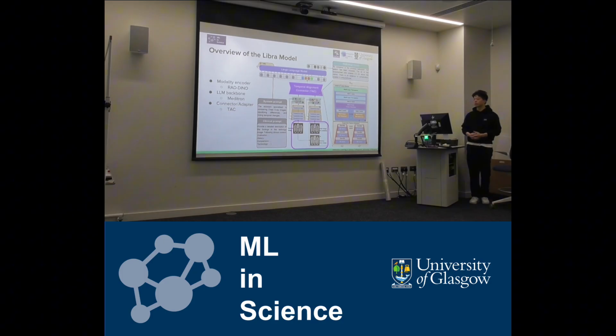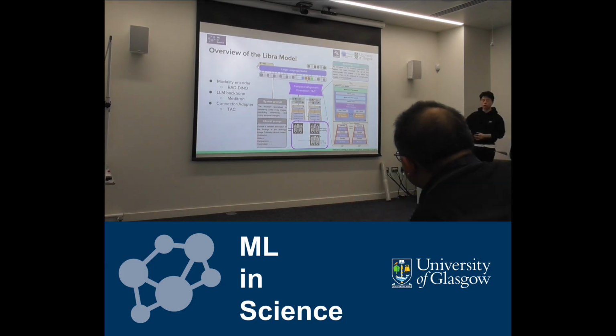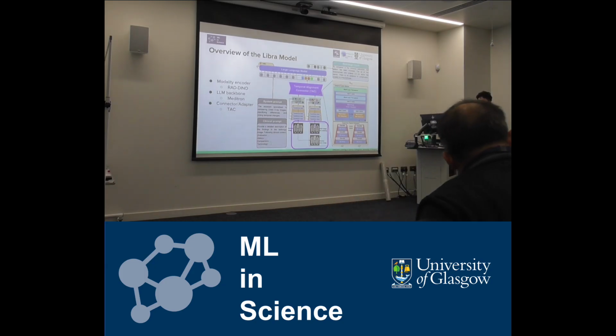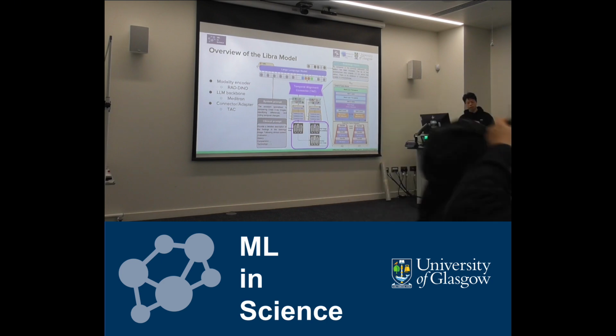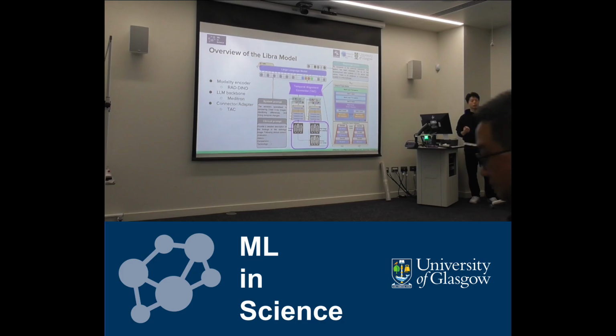So what matters is that by modeling the temporal relationship at the architecture level, this kind of model is closer to the real-world setting. For example, imagine that the doctor sees a patient's condition remains stable, which means the current scan and the prior chest X-ray are nearly identical. The doctor cannot see any difference between these two images. That's why we should align our model's architecture accordingly.